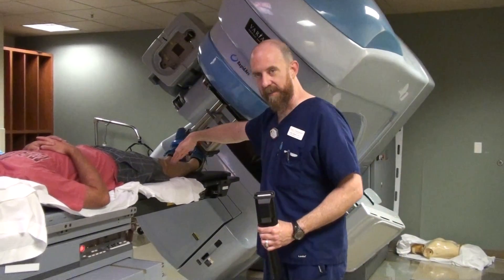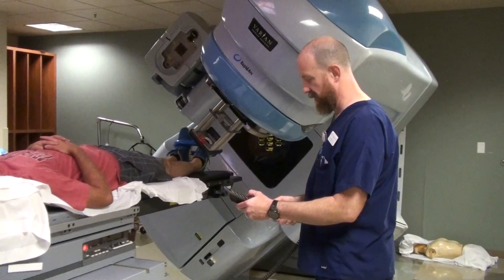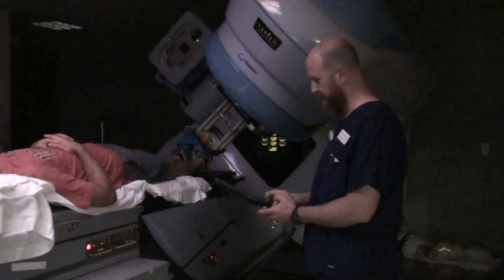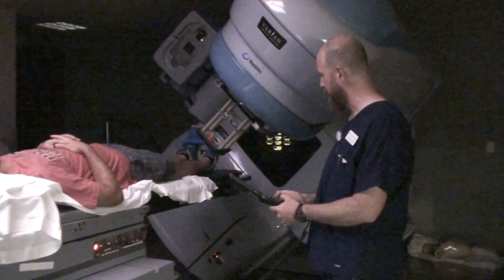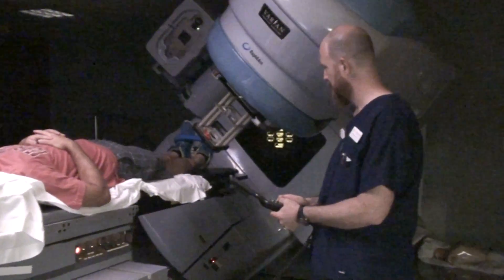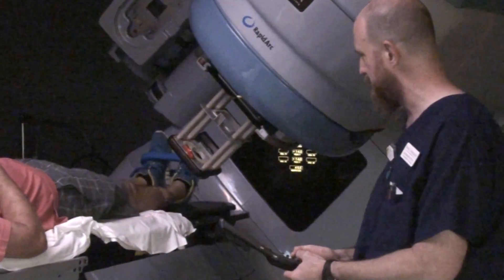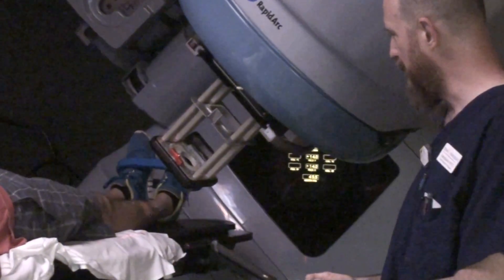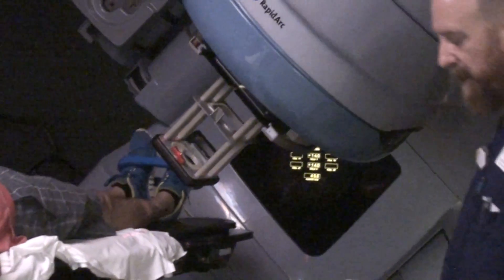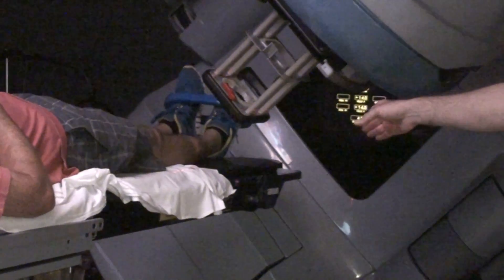Your perpendicular line is coming in at an angle. First we're going to line this patient up at a distance. We're at an extended distance, but this is not where you want to actually treat your patient. So I'm just moving in, out, left, right, and not up and down. My projected field is approximately on the circle.